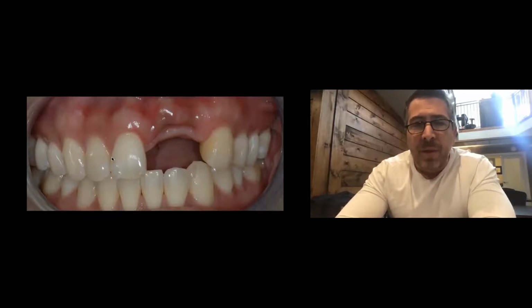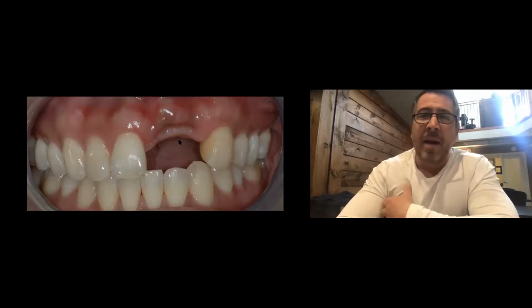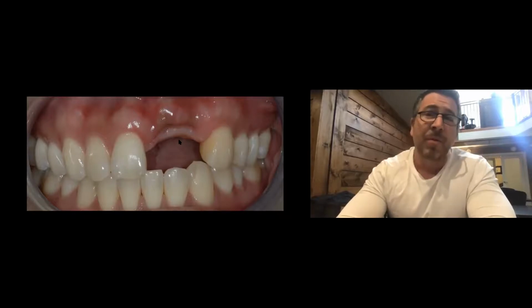So what I want you to be able to look at, from the photo alone, is where the papilla between the 1.1 and 1.2 is. Extrapolate a line coming across, and we draw that line across, look how big that defect is vertically between where the 2.1 and 2.2 are going to be. So we have a problem with the zenith issue in the sense that the crest of the bone is really high, and we're not going to have a good interdental height of bone between these two teeth. So I, in my hands, need to reconstruct this ridge before I do implants.